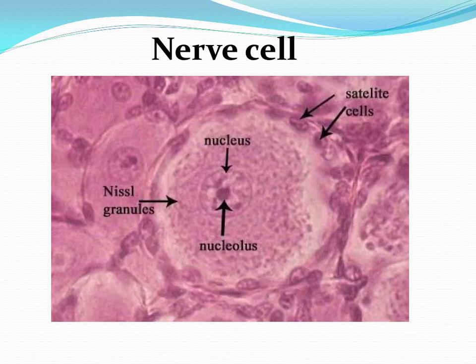What are the possible questions in this picture? First of all, what is the type of this neuron? This neuron, as you see, is smooth and rounded, which means that it is unipolar. For the unipolar nerve cell, you should study at least one example. It is the cells of the dorsal root ganglion or the spinal ganglion. So it is a unipolar nerve cell, and the example is the cells present in the spinal ganglion and also in the mesencephalic nucleus of the trigeminal nerve.